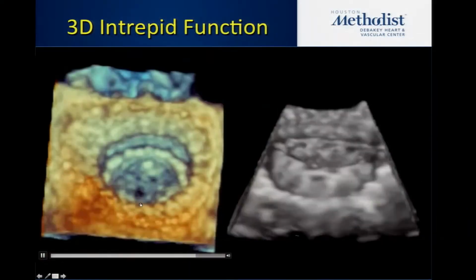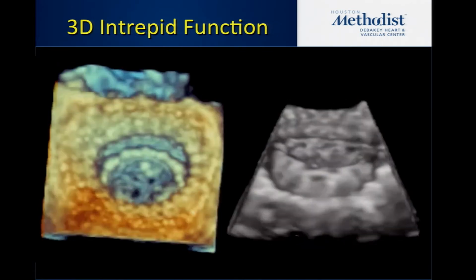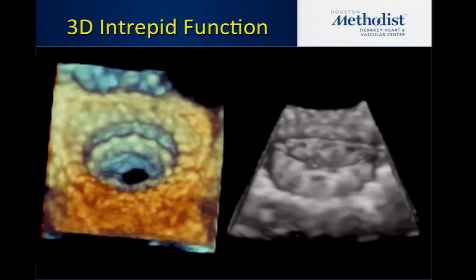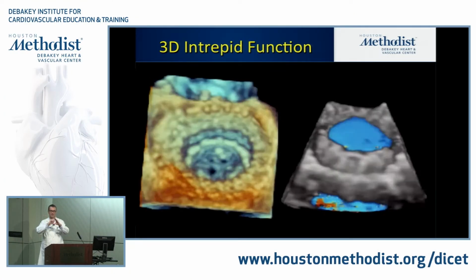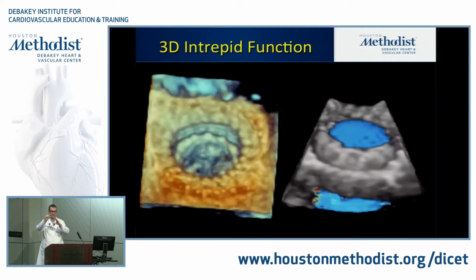So this device actually is a frame within a frame. There's one frame, nitinol, that makes all the annular contact. It's the one that gets beat up and moved and has to conform. Then there's another frame inside, a complete circle. So no matter what happens on the outside, this valve is going to maintain its circle. But it has a little trough all the way around the outside.